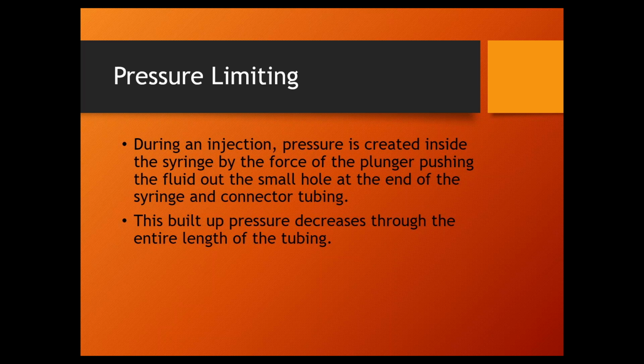And if I say I want to inject 20 milliliters of fluid into the patient, we're going to inject 20 milliliters. We're not going to stop at 19. We're not going to go to 21. We do 20 milliliters exactly, and we're done. Now the pressure limit, that's not the goal. The pressure limit is just saying don't exceed this.